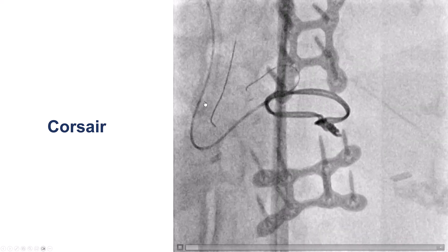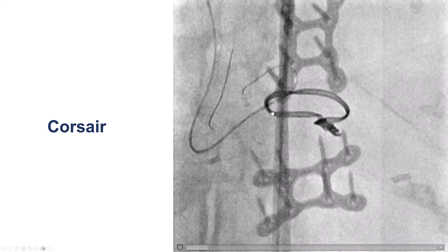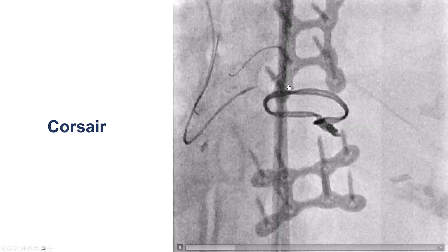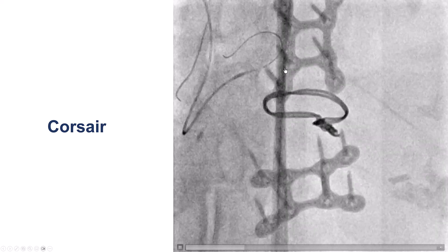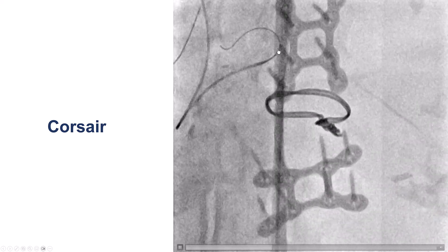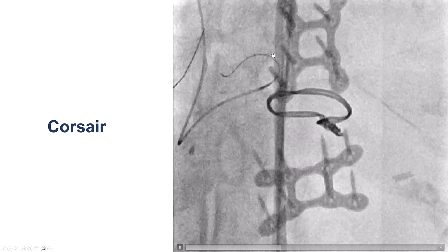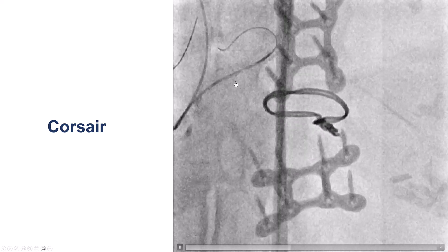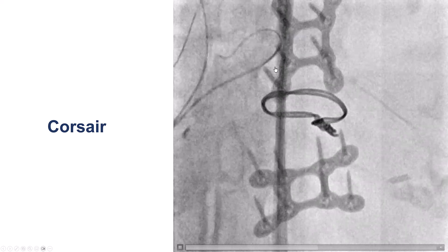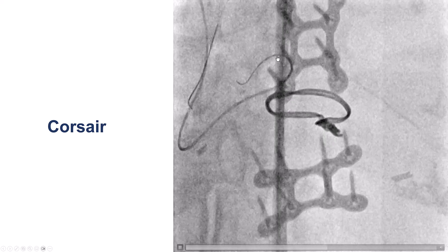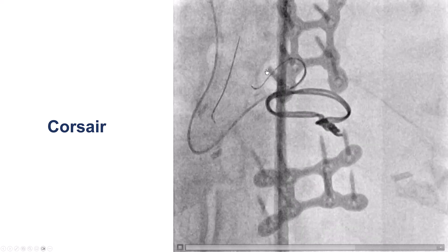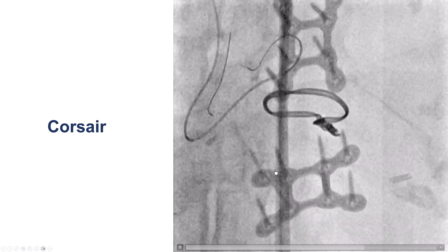The Pilot very nicely took this bend from the vein graft to the PDA close to the distal RCA. We were then able to navigate with the Corsair through this tortuous area — this 180-degree bend — to go into the PDA and then close to the distal cap. This step can sometimes be challenging, but we were able to advance the Corsair here without too much difficulty.